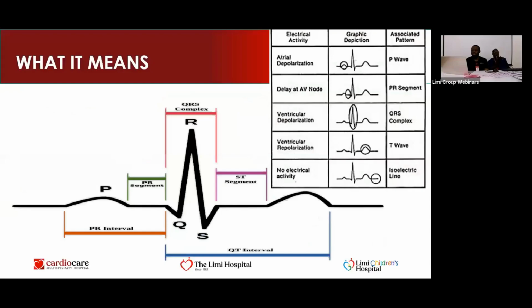If you are looking at the screen, what I'm showing you is what you have on your ECG. You just have it repeating itself over and over. It's like a piano. You have different parts and then you just repeat them. What you have is the P wave, the QRS complex, and the T wave. Occasionally there can be a U wave, but this is all you have.